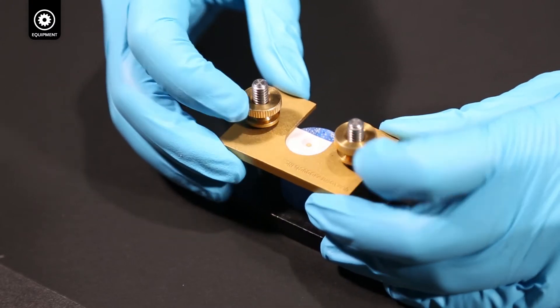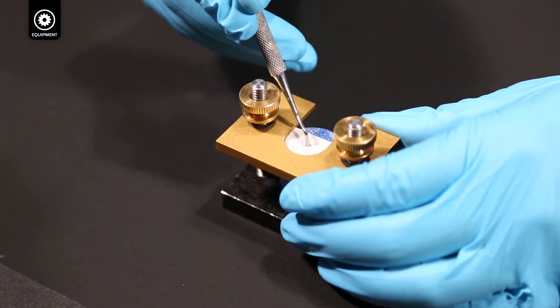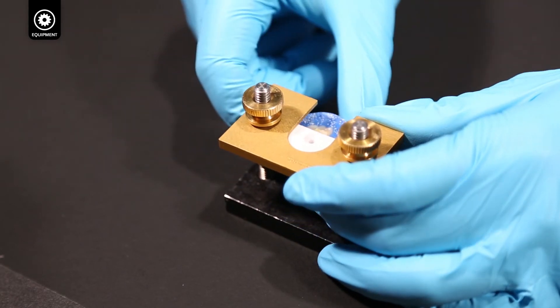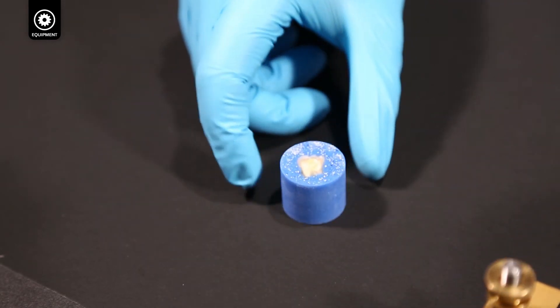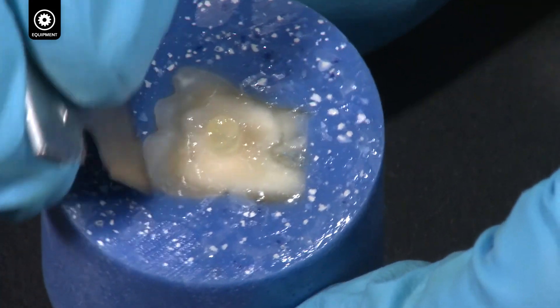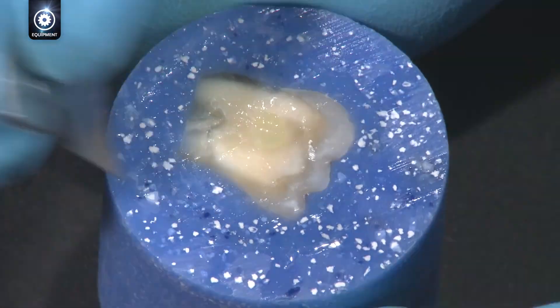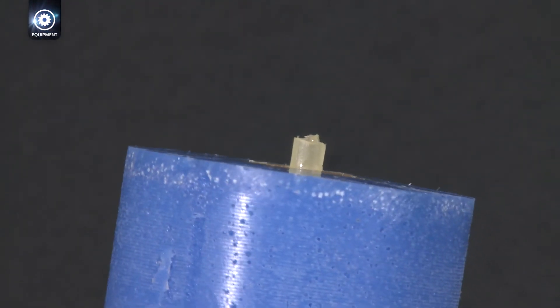Loosen the thumb nuts. Hold down the cured composite with an instrument while lifting the gold top of the clamp. If there is excess flash from the base of the composite, remove it with a razor blade. The bonded specimen is now ready to be tested.